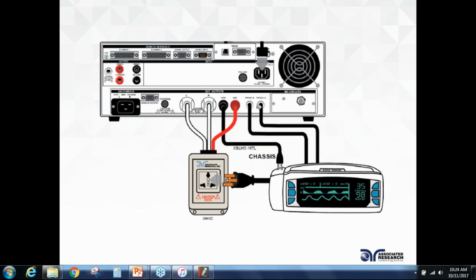This is no different than taking a DMM and measuring a voltage between 2 points in a circuit or 2 points on your device. But a DMM does not have the measuring device built in. So a few things I mentioned earlier about needing a measuring device to accurately simulate what a human body current will look like.